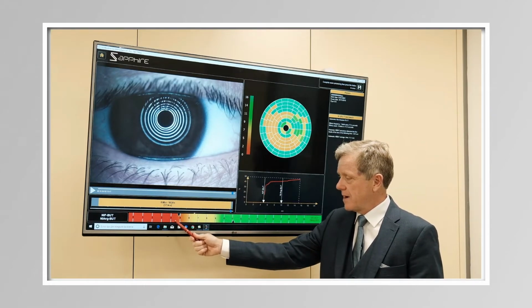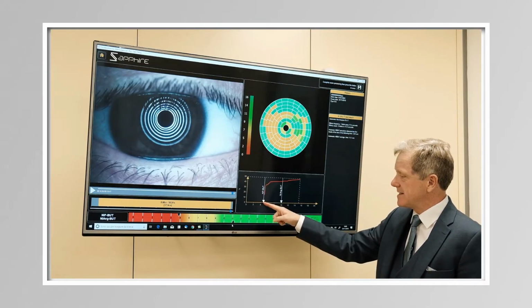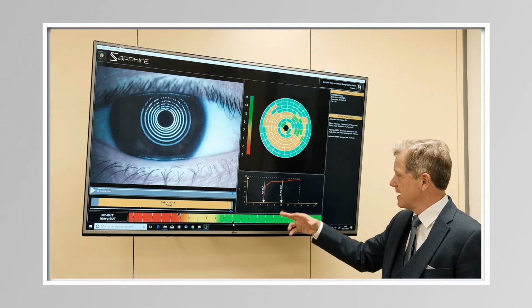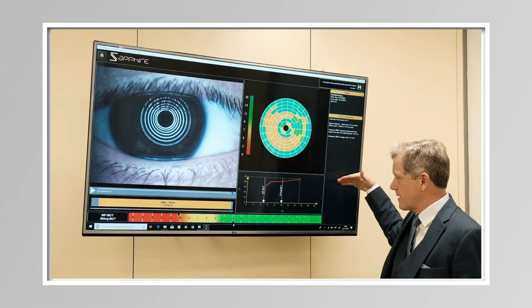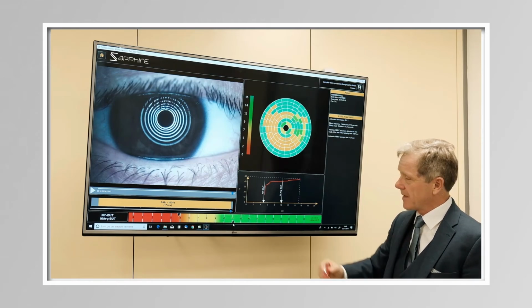And in this case, we might look at the very first time the tears are breaking up, around about 5 seconds. Again, this is demonstrated on the graph here, where we're getting a partial breakup of the tears around about 5 seconds, and more complete breakup as time progresses around 10 seconds.